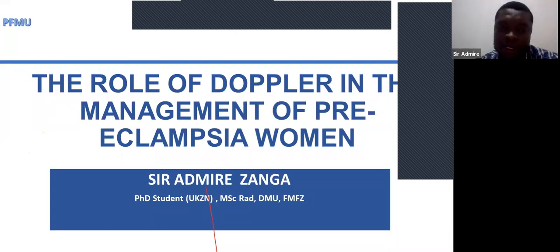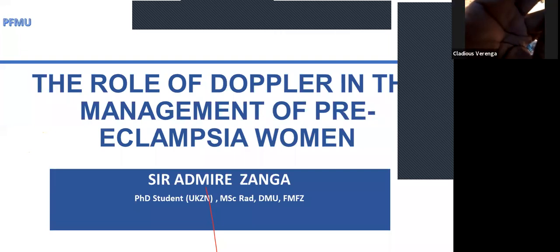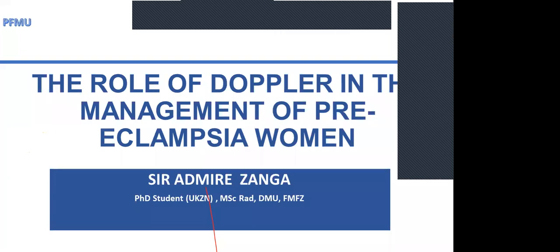Okay, yeah, I get you. Around 15, 16 weeks, usually we don't do the Dopplers, usually from 20. I just wanted to chip in on that one, because remember, from the presentation, when we look at early onset growth retardation, we are looking at an issue of perfusion. So this is why the uterine artery is very critical in that regard.